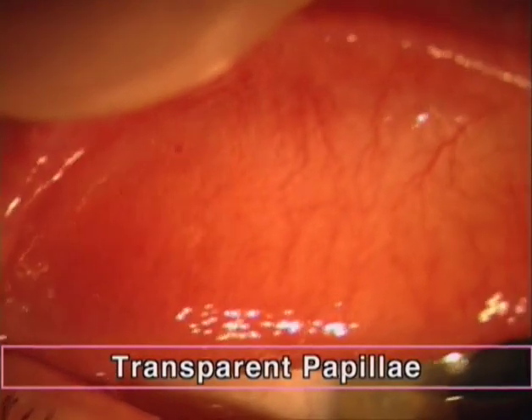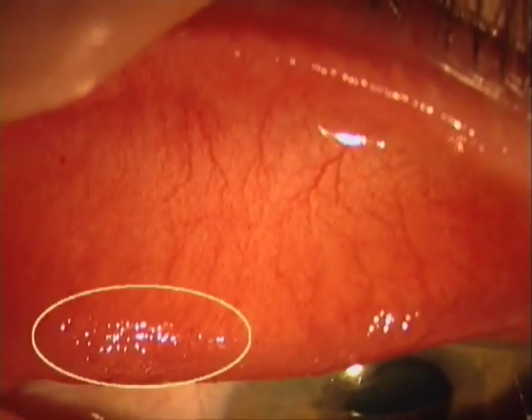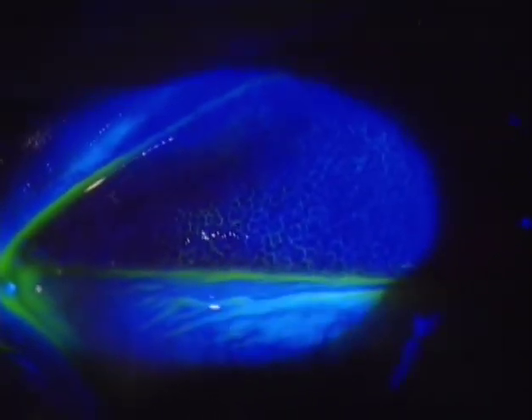Transparent papillae. Papillae produce irregular reflexes caused by the hundreds of small surface elevations, and the furrows caused by the septa can be found by staining the tear film with fluorescein. The margin of a single papilla, although perhaps invisible at first glance, can be detected by using indirect lateral illumination. And in retrograde indirect illumination, we can recognize also the tiny central capillary buds, which are the main sign for diagnosing papillae.